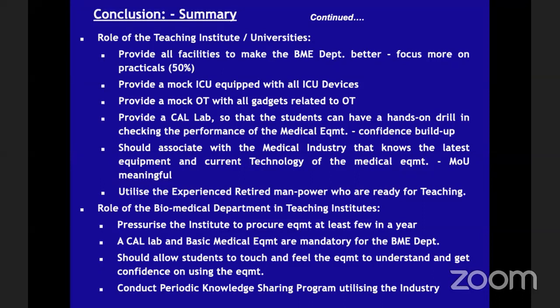There are refurbished equipments available. You can buy from them, and they have after-sale support. A CAL lab and basic medical equipment are mandatory for the BME department. Anna University has a beautiful CAL lab. NIMHANS has a beautiful CAL lab. There are so many institutes there from Chennai. We have given a proposal for a CAL lab.